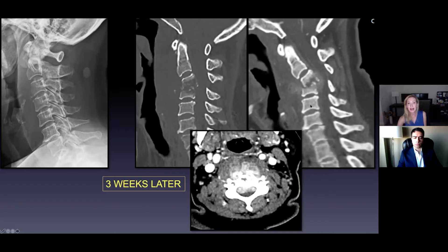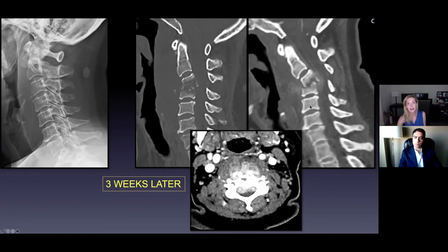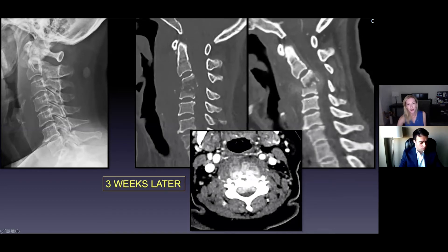This patient got another CT scan with contrast. That's not the normal way things go, but at this county hospital MRI was not immediately available. The surgeons used this for surgical planning until MRI could be obtained, as this was a case they wanted to treat emergently. You can see subluxation and loss of normal cervical alignment. On this post-contrast CT there's enhancement from the spine and behind the spine — in the epidural space and the prevertebral space — where there should be no soft tissue or enhancement.